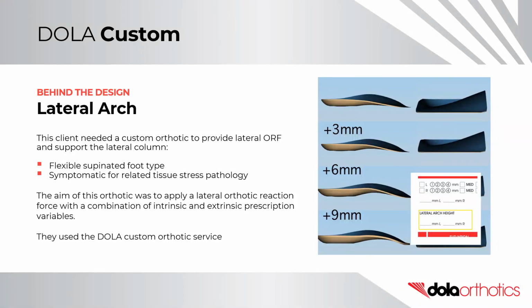Behind the design. Lateral arch. This client needed a custom orthotic to provide lateral orthotic reaction force and support the lateral column. It was for a flexible supinated foot type with symptomatic tissue stress pathologies.